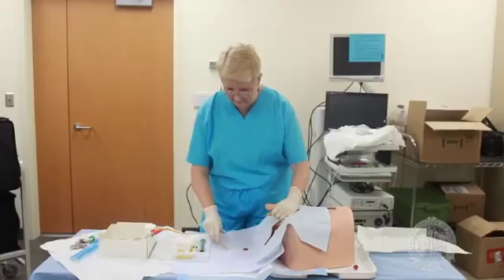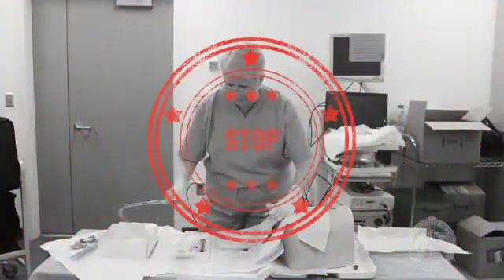By far the most common error is a break in sterile technique. Once your non-dominant hand touches the skin, it's contaminated and cannot touch any of the tubing or the catheter. Likewise, your dominant hand must stay sterile and not touch the penis or vulva or outside the sterile field. Another common complication is urethral trauma secondary to insufficient lubrication, leading to pain on insertion. If urine leaks around the catheter, gently tug it to see if the balloon is inflated — if it is, you may need to replace the catheter with a larger French size. If no urine drains, ensure the catheter is fully inserted, deflate and re-inflate the balloon when you are sure you are in the bladder, and gently press on the bladder. If you place the catheter and get return of frank blood, it is likely either misplacement of the catheter, traumatic placement, or attempted removal before the balloon is deflated. It can also be from infection, post-urinary tract surgery, stones, trauma to the urethra or pelvis, or cancer in the GU tract.